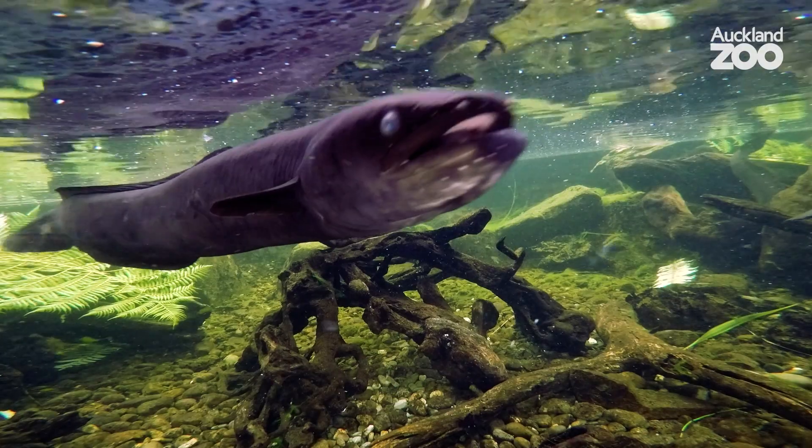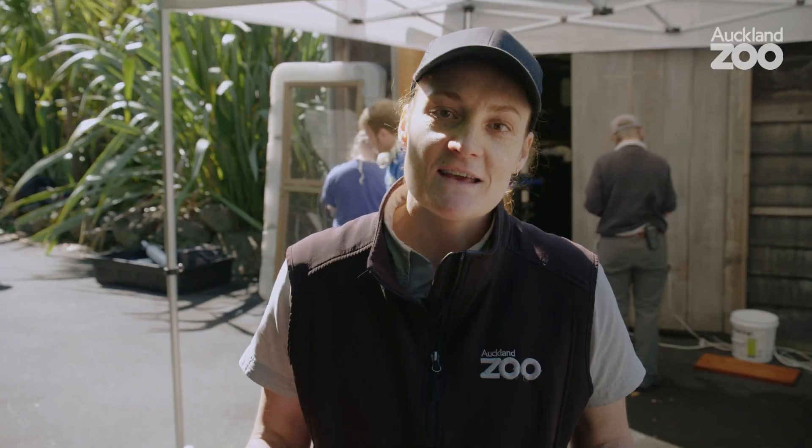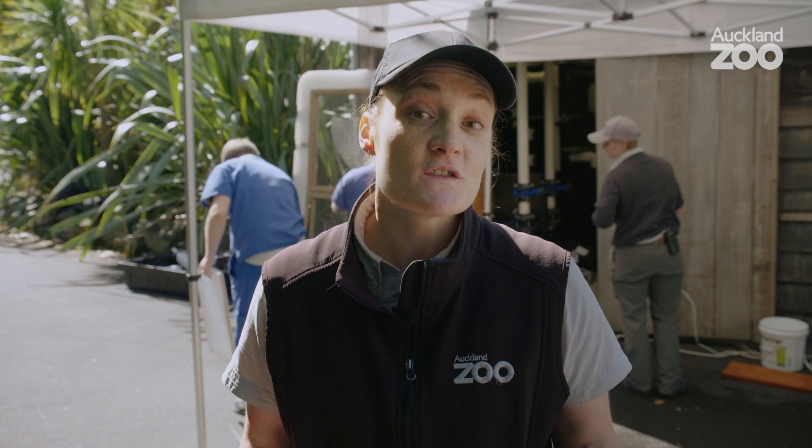We've never anesthetized an eel before, so normally they're very wriggly, very hard to get hold of or get close to and have a look at.